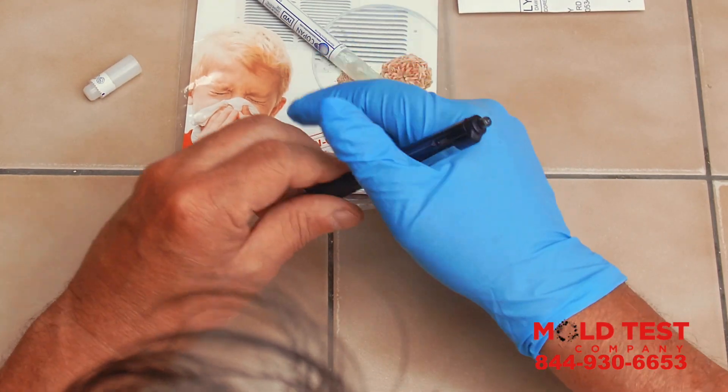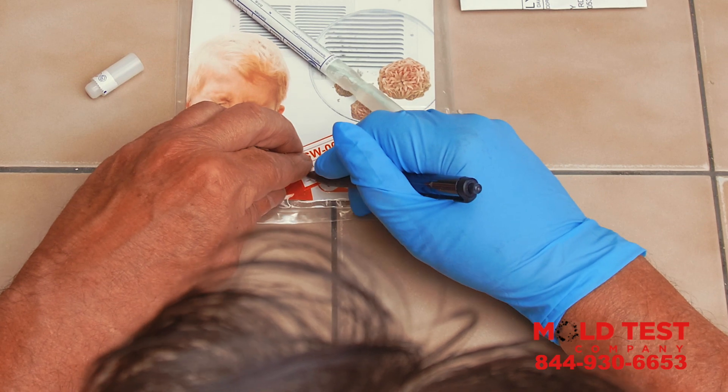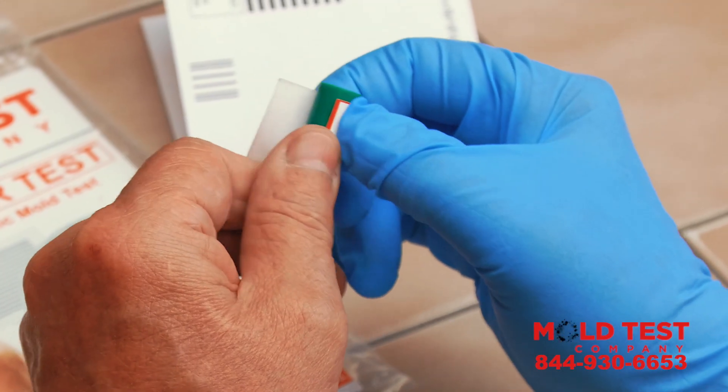Step 3. Print your name on the SW-001 sticker and place it around the back portion of the swab.